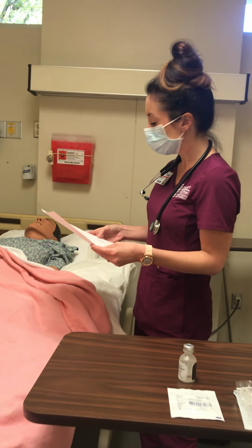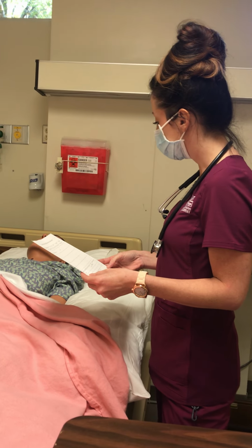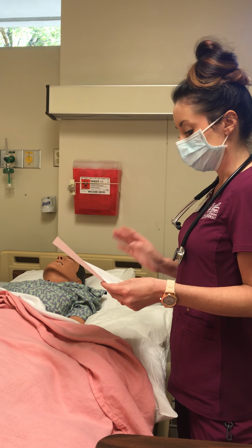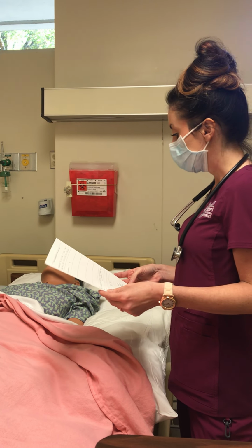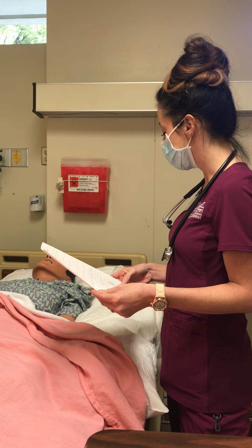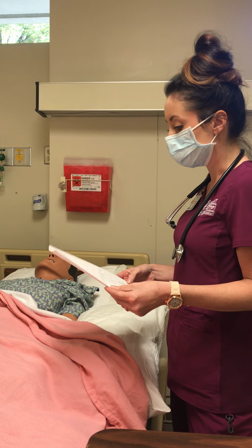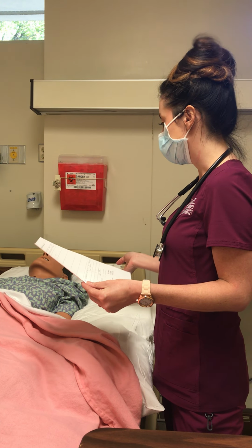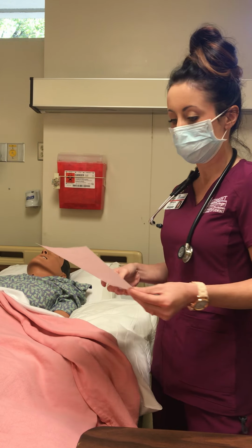And Mr. Jones, can you verify where they gave you your previous methylprednisolone injection? On your right ventrogluteal site? Okay, that's what I have here on your medication record. So I'll be administering that on your left ventrogluteal site today. And it is contraindicated to give that in the deltoid area, so that's why we're not giving it there, because it could cause some atrophy in the deltoid area, okay?